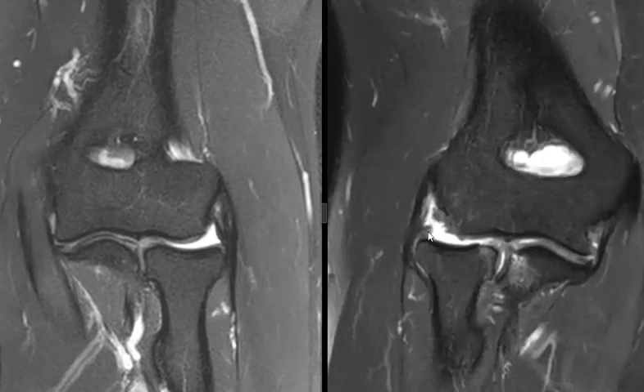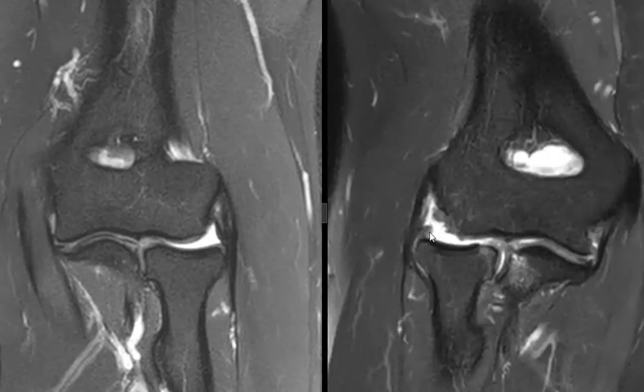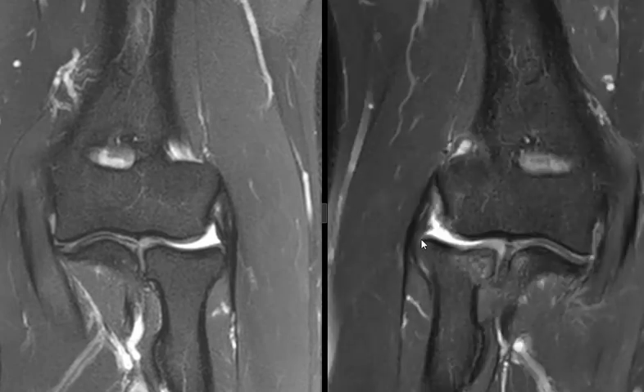The lateral ulnar collateral ligament comes up and then stops right here — there's the end of it. The reason we see this so well is probably because it's torn and retracted back a little bit, and it's lax and a little thickened in this area. So this is a ruptured lateral ulnar collateral ligament.